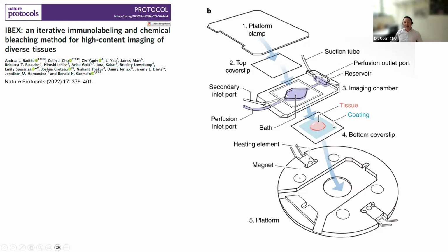In this case, you then have this reservoir, which is around 200 microliters, where the microfluidics would come in from the left, fill it up, would be pushed through into this reservoir and then suctioned away into a waste vacuum pump. This was then clamped together, and this bottom base would not only be heated to 37 degrees, but would remain unmoving on the microscope stage, and then the microscope would be an inverted microscope in this case coming from below to image the tissue.